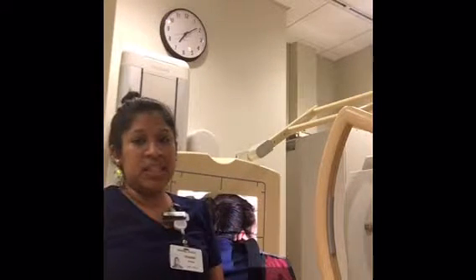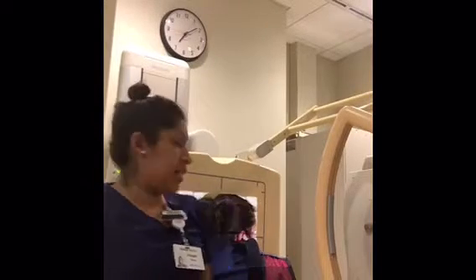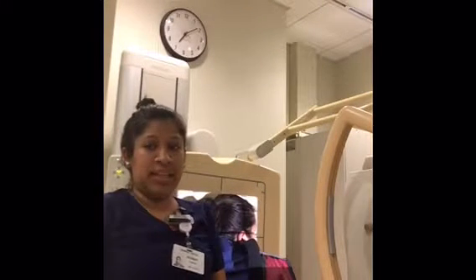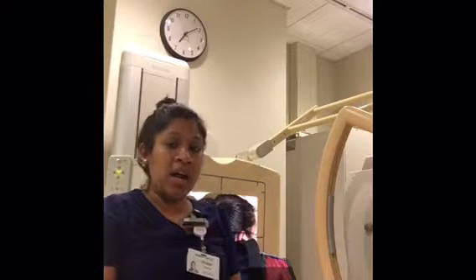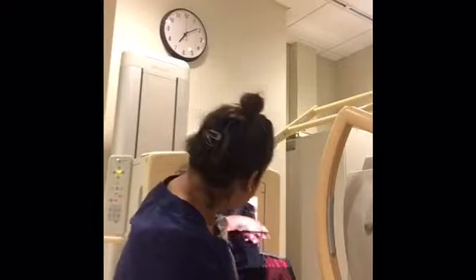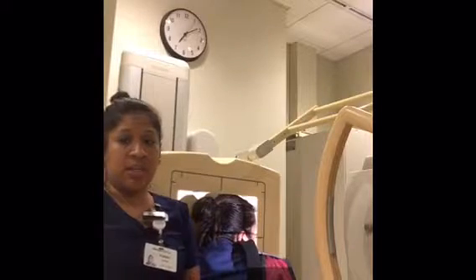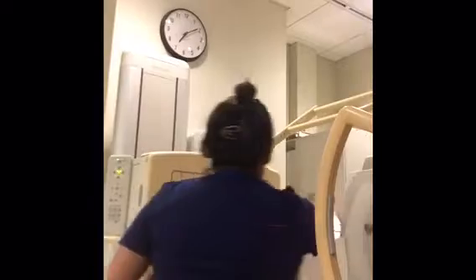And the MSP is parallel to the plane of the IR, and we can see that our MSP is parallel to the IR, and our interpupillary line is perpendicular to the IR, and our IOML is perpendicular to the front edge of the IR. So we can see that it is perpendicular to the front edge of our IR. And now we are ready to shoot the image once I put my left marker right over here.